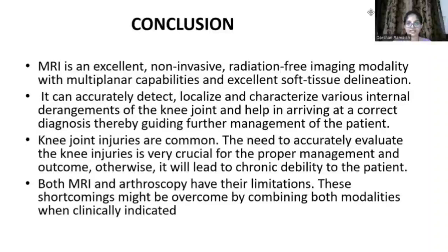In conclusion, MRI is an excellent non-invasive, radiation-free imaging modality with multiplanar capabilities and excellent soft tissue delineation. It can accurately detect, localize, and characterize various internal derangements of the knee joint and helps in arriving at a correct diagnosis, thereby guiding further management of the patient.